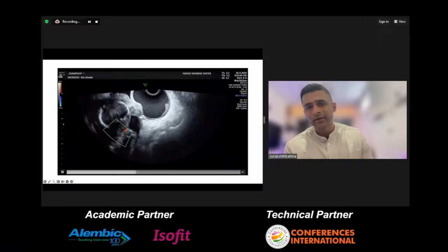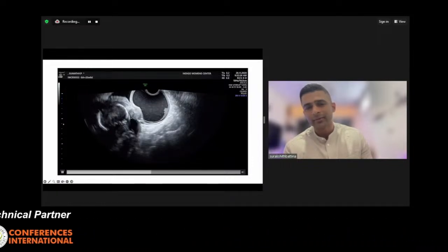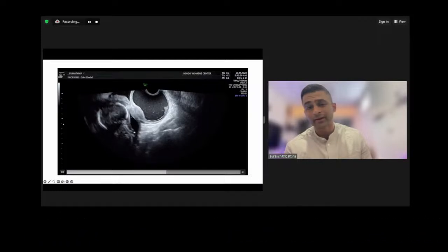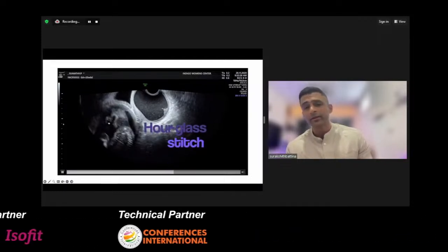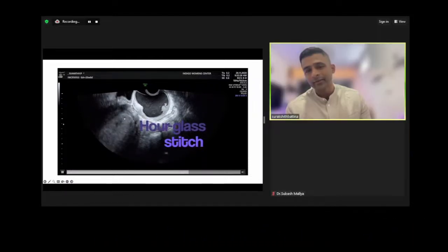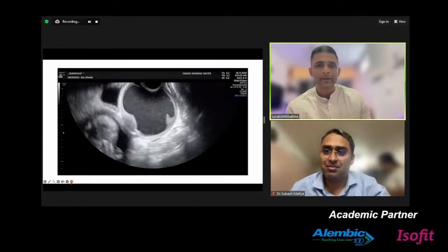But then, you can see that after placing the stitch, there is this whole hourglass kind of appearance over here. You can see there is free fluid moving between the two amniotic sacs. Surprisingly, this lady crossed 36 weeks with no problem, and at 36 weeks the sac ruptured. At that point we had to take her up for a C-section, and it was absolutely fine.